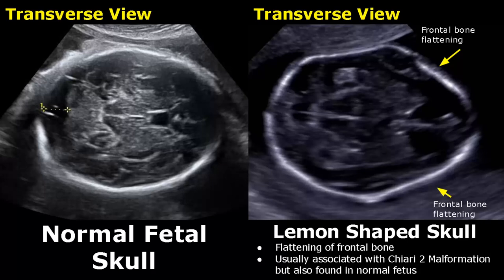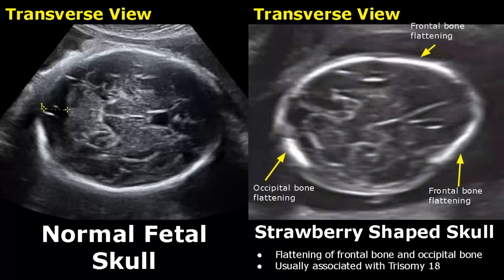In a strawberry-shaped skull there is flattening of both the frontal bone and the occipital bone. It is usually associated with Trisomy 18.